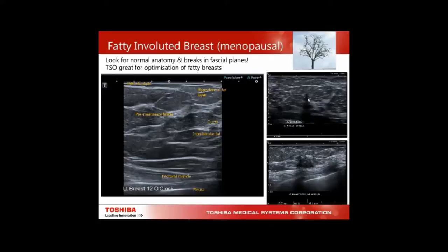This lesion is eating through the premammary fascia. Even areas that are shadowing — and this was a very large breast not seen on mammogram — can show an area of shadowing where ducts have been bitten away and then start up again on the other side.